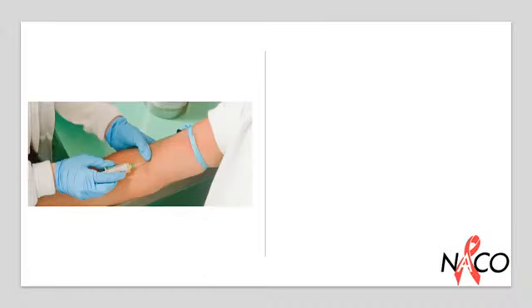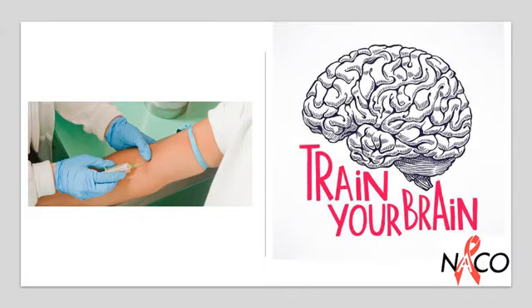Phlebotomy is a meticulous task, and any error in performance can have consequences. So far, we have learned about the local complications. Just to recapitulate, which are improper positioning of needle, rolling of vein, puncture through vein, needle bevel obstruction, collapsed vein, partially inserted needle, tube pop off, anticoagulant reflux, tourniquet not removed, excessive bleeding, petechiae, and nerve damage.